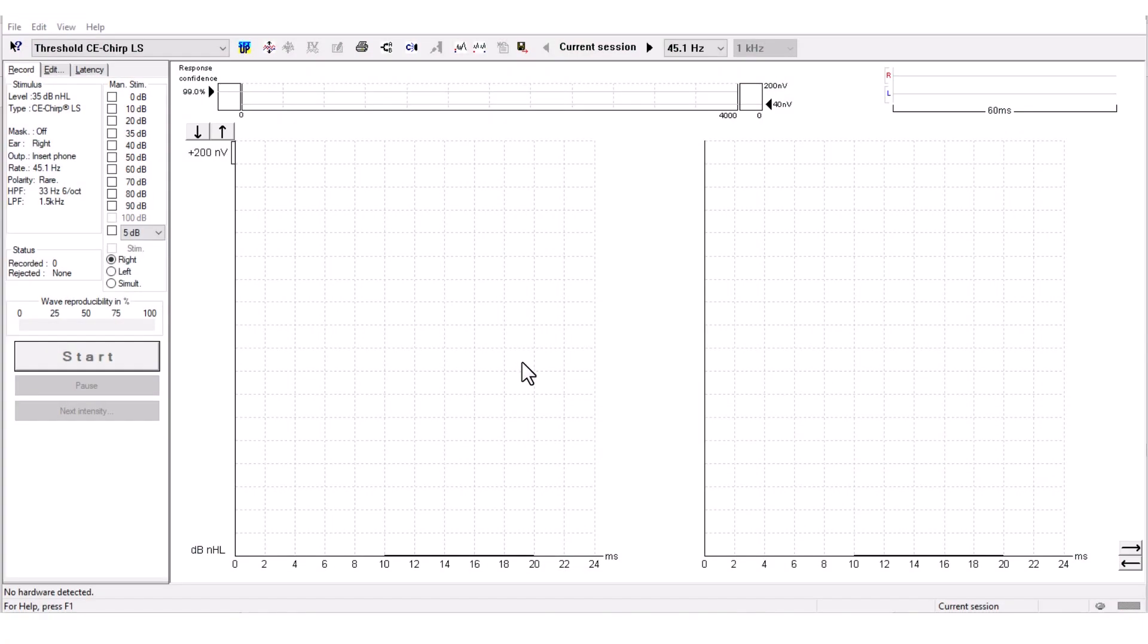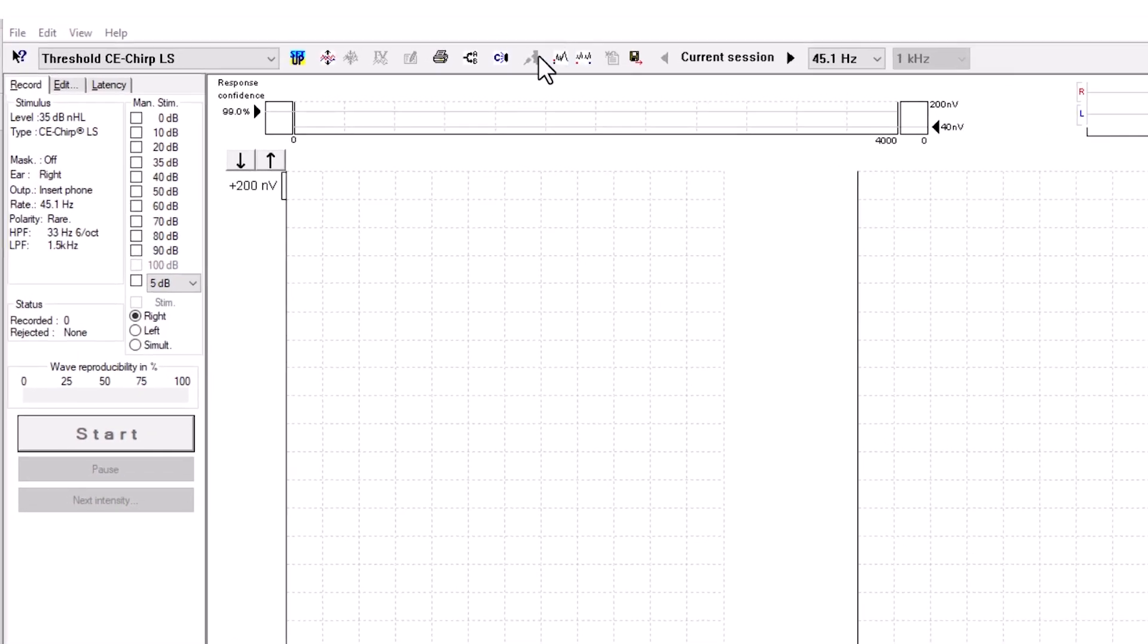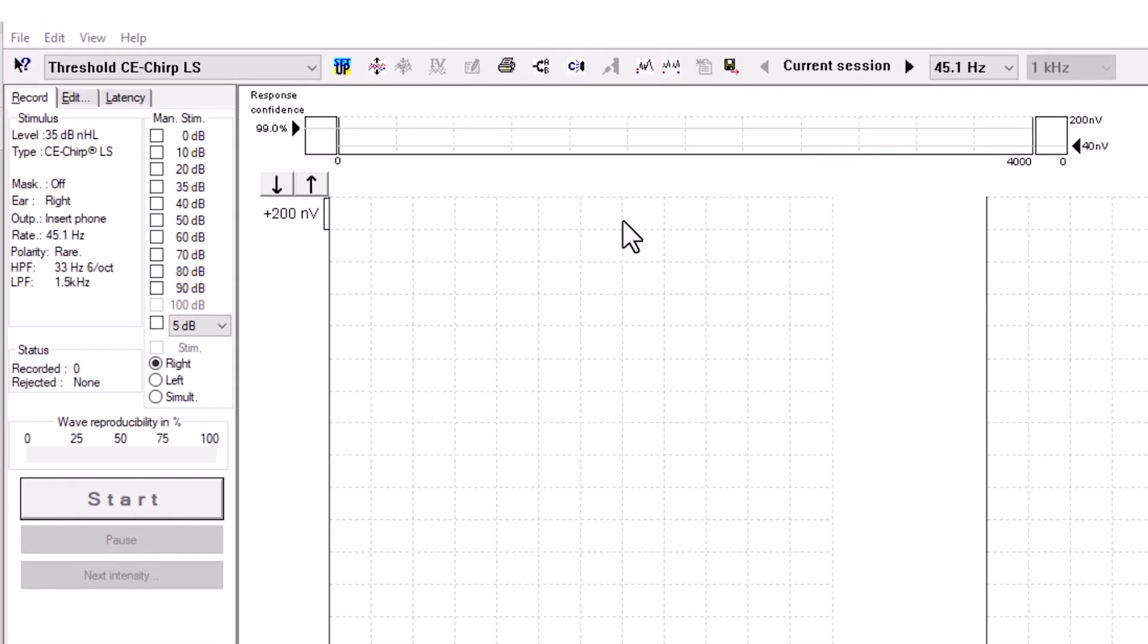How to use the top panel. This is how you navigate the top panel of the Eclipse software. Let's look at the different functions and options available to you.